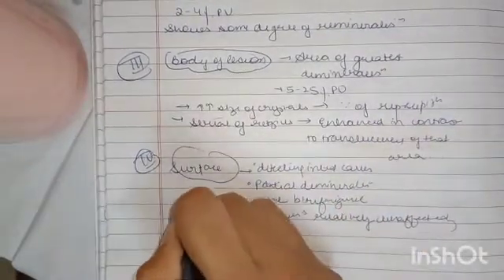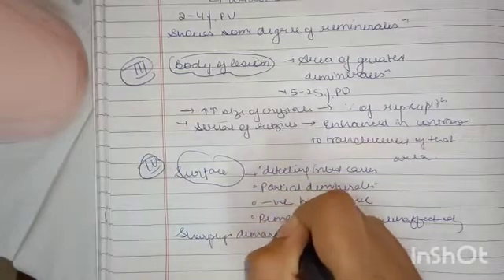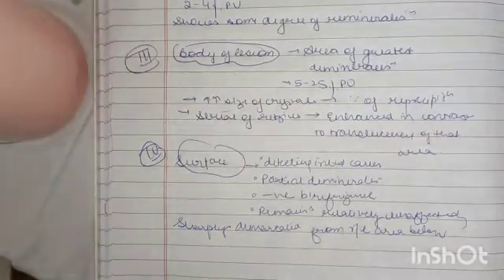It is sharply demarcated from the radiolucent area below. Also, it remains intact.